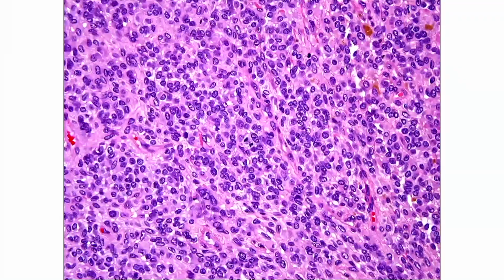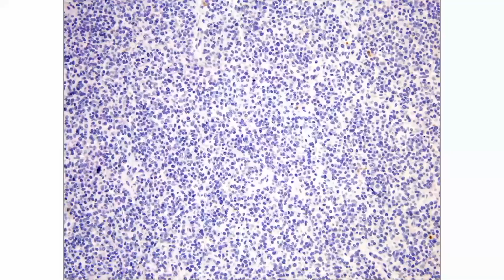So, pretty uniform, monotonous cells. There is a mitotic figure in the center, but they're pretty uniform and monotonous. There's not a lot of pleomorphism. So it's on the hand, acral surface. So I know, I'll do some immunostains, and that will really solve the problem, right? Because immunostains solve everything.